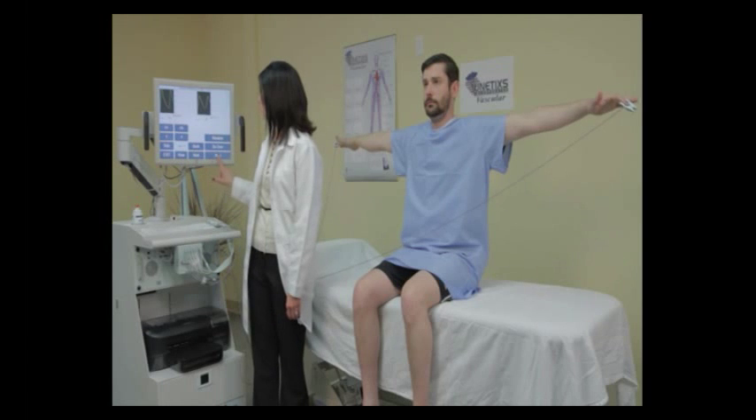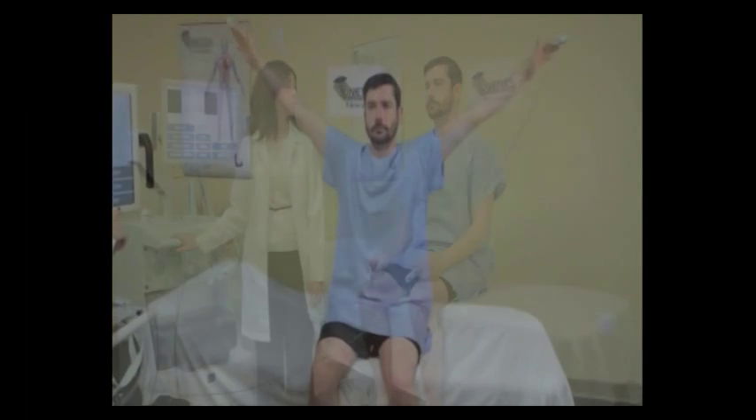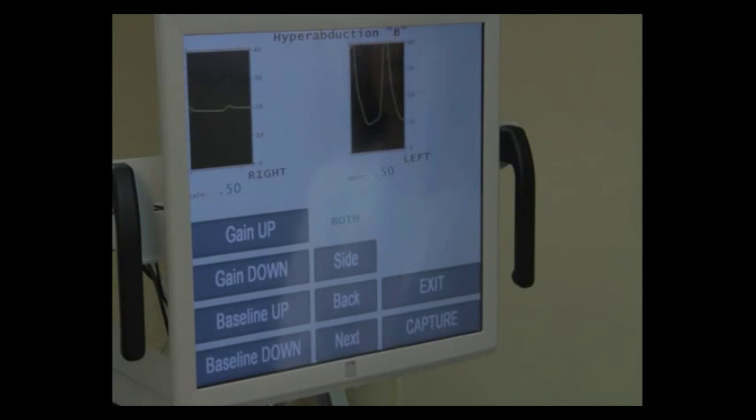The next position is hyperabduction B. Ask your patient to put their arms straight toward the ceiling with the palms facing forward. Wait for the waveforms to become consistent — they may be getting smaller on one side.